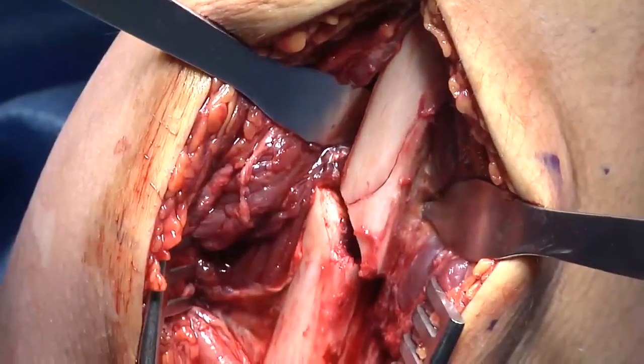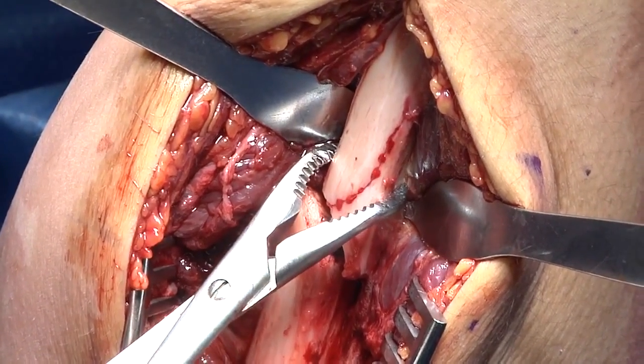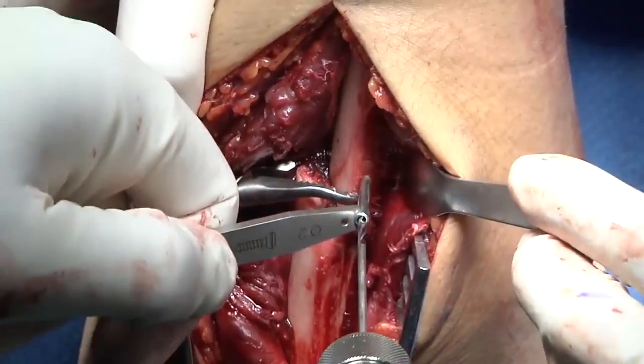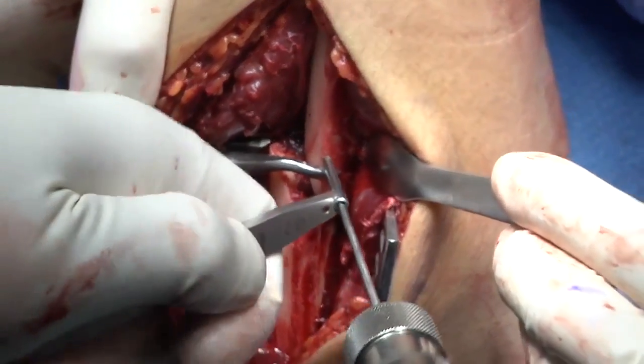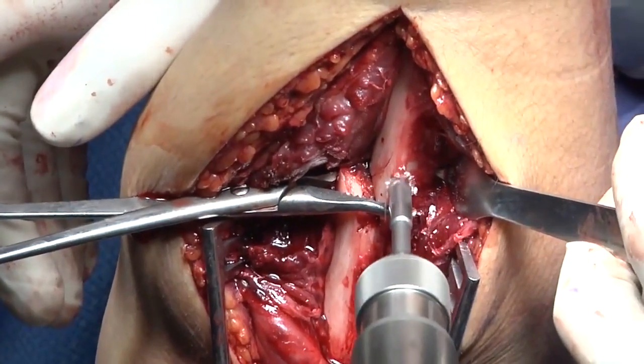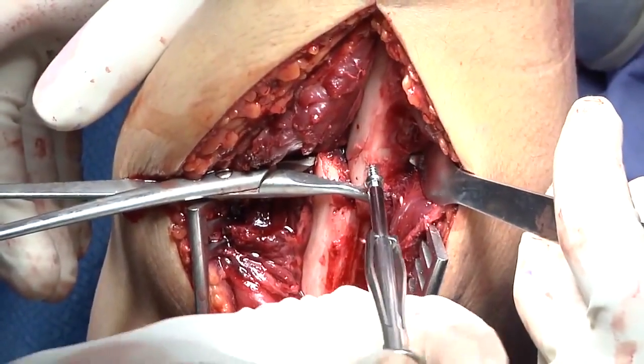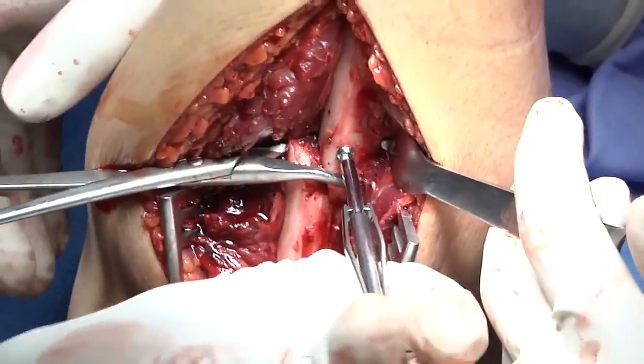Here, an undisplaced butterfly fragment can be seen. This fragment is compressed with a reduction clamp and then lagged with a 2.7 millimeter mini fragment screw. The use of mini fragment screw fixation can be helpful to avoid comminuting small fracture fragments and to allow the insertion of lag screws that will not interfere with plate placement.